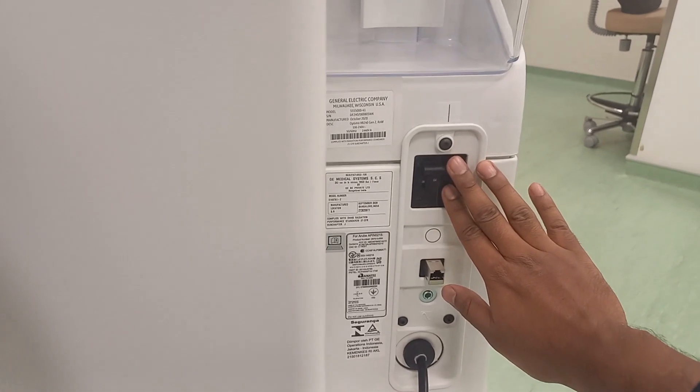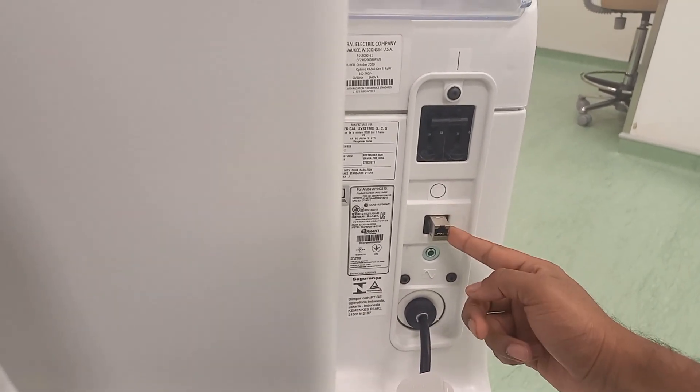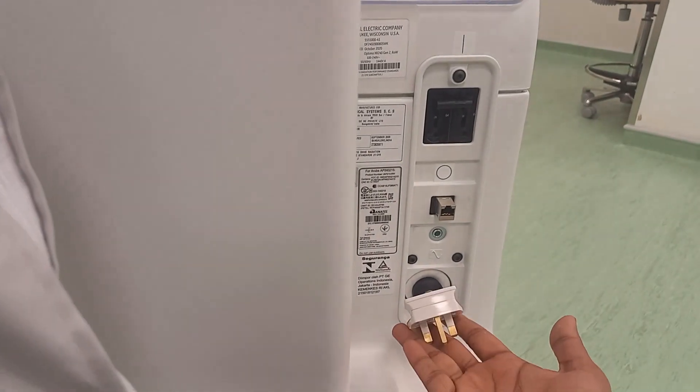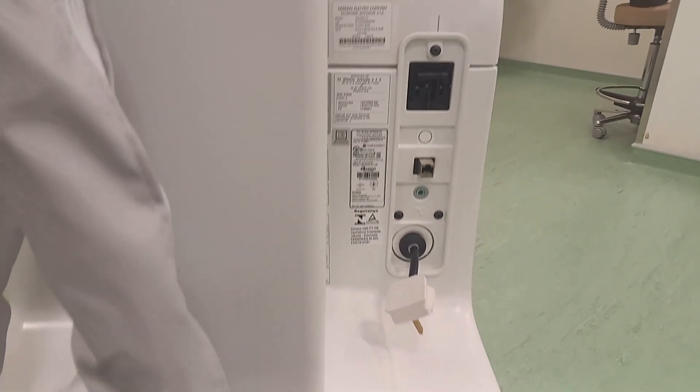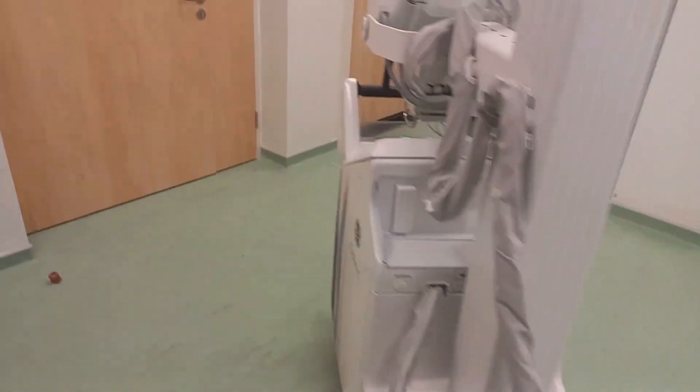You have your circuit breaker, your connection port for the hospital wired network, and your cable — the power cord to charge the system batteries.